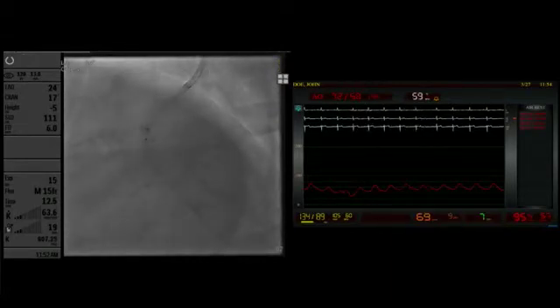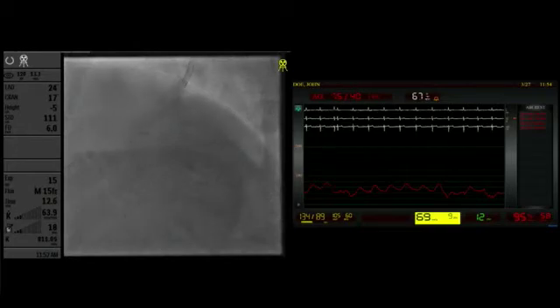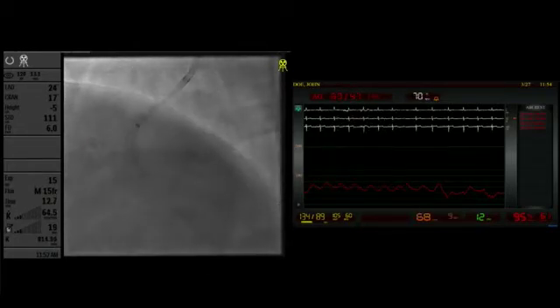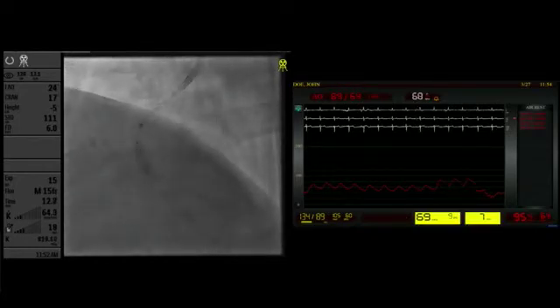I think that's just exactly what I'm asking. Moving the energy up and down this segment. Yes, I'm going a bit more distal now. Okay, 4, please. Jonathan, you are correct. And again, this is a 3.5 balloon. Yes, sir. It's making good progress.